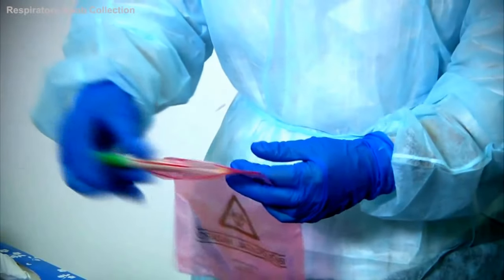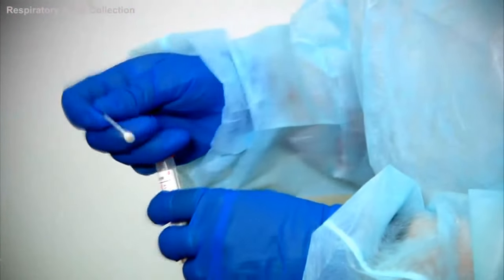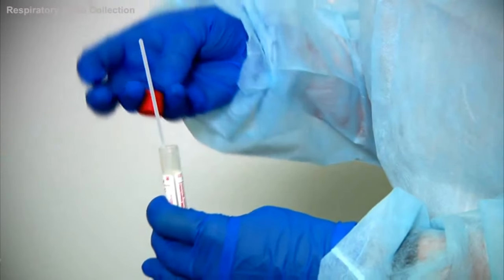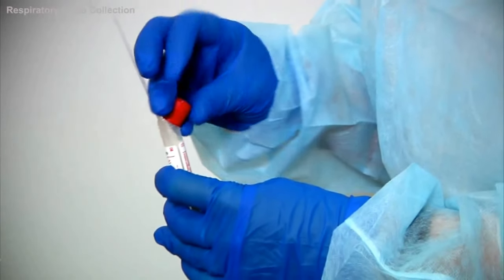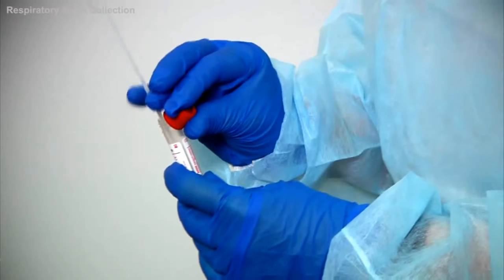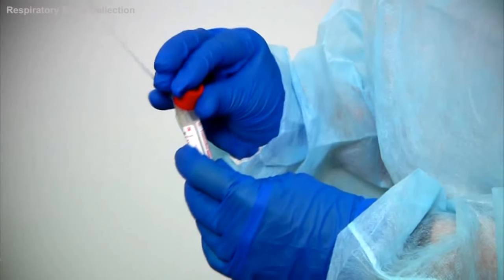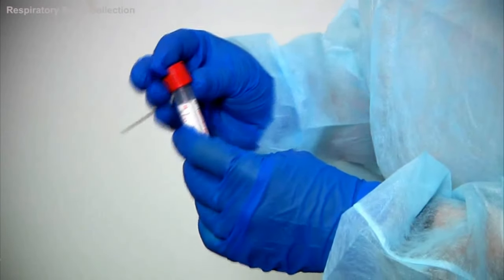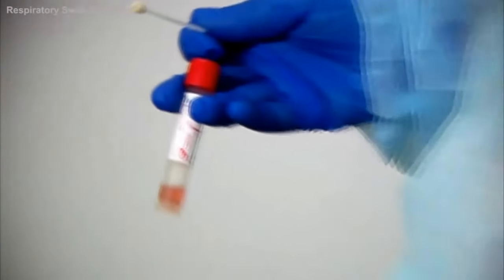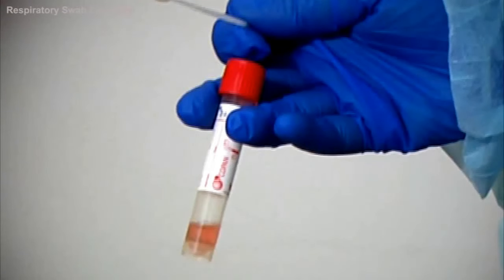If you're using the UTM tubes, the swab should be carefully placed into the tube as demonstrated. The cap can then be used to help snap the shaft at the snap point. Ensure that the snapped end of the shaft fits snugly into the middle of the cap, then close and tighten the cap. As the medium used in this system is a liquid form, care must be taken not to spill the contents of the tube. Now, take out the second swab.